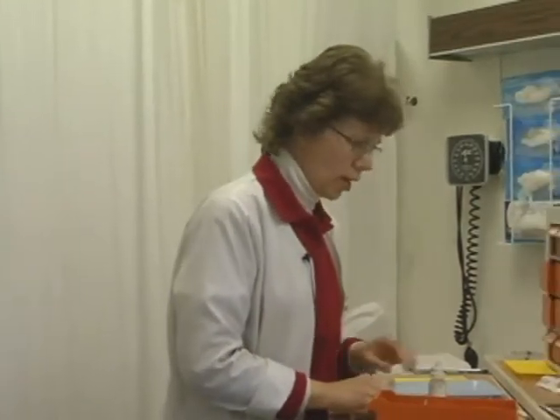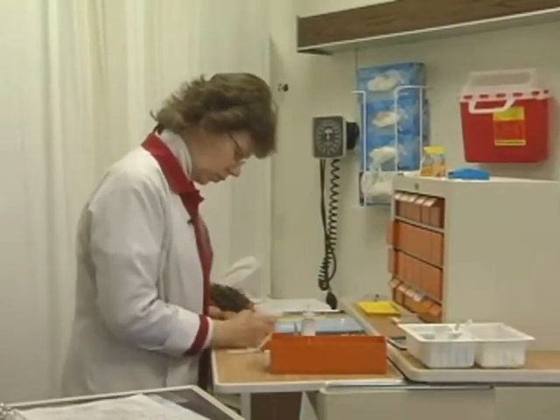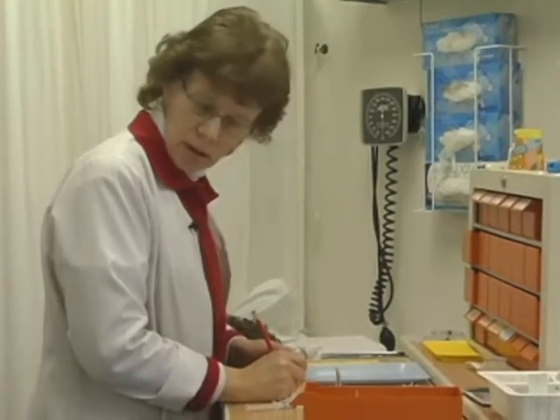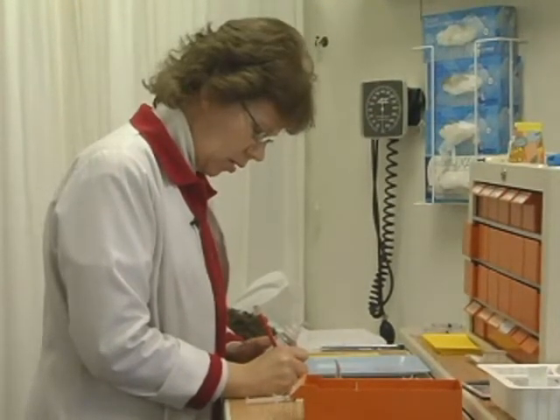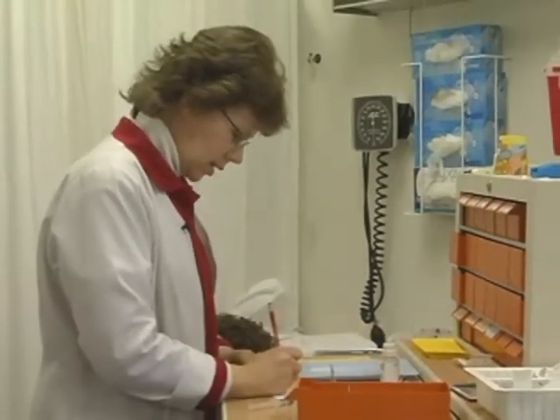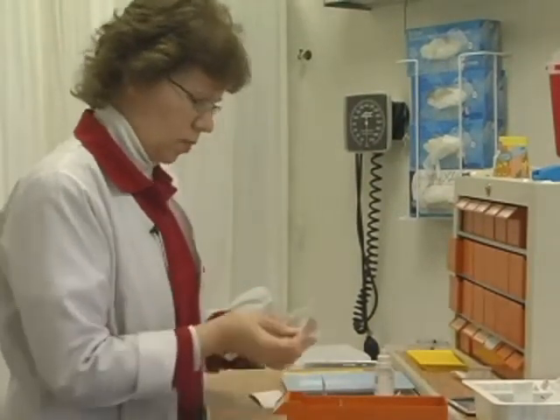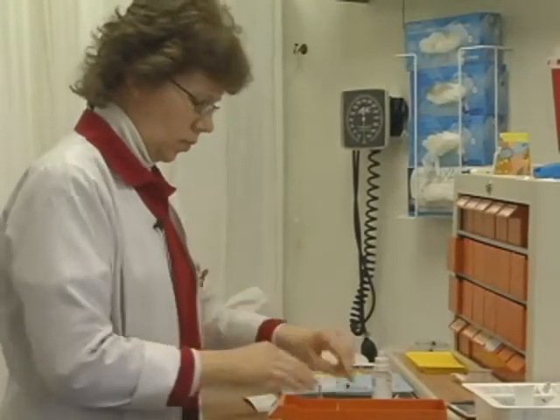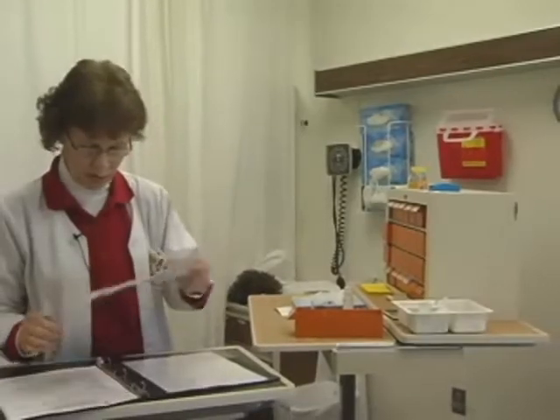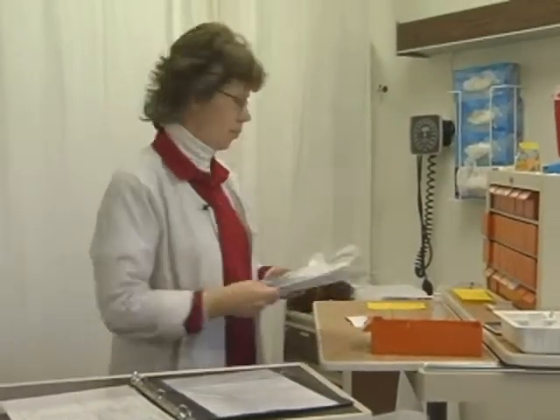Okay. So my second check is done, and now I will label my syringe. Harmon Wagner, 47672. He gets 4 milligrams of Zofran, and the calculation is 2 ml. IV push. Last given at 12 midnight, due every 4 hours. I'll put that on my syringe. Grab some alcohol and my gloves. I need my MAR, so I'll take that with me. And now I'm ready to go to my patient's room after I clean up.